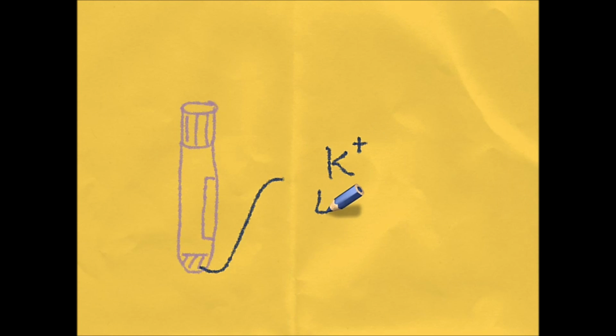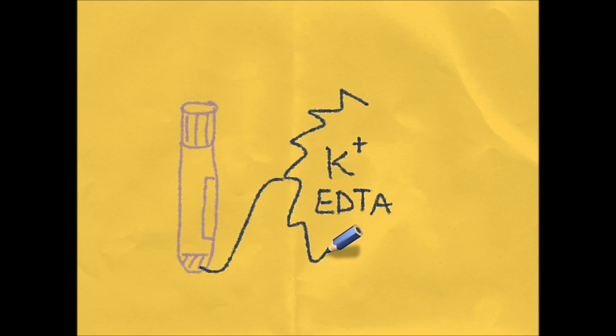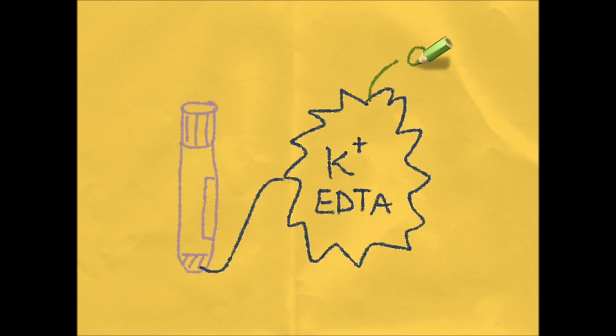To get information about individual cells or platelets, we need to make sure that the blood we're analysing isn't clotted. So full blood count tubes contain an anticoagulant, usually potassium EDTA, which acts to chelate calcium ions. Calcium ions are crucial for the blood clotting process, and so removing them means that the blood shouldn't clot.